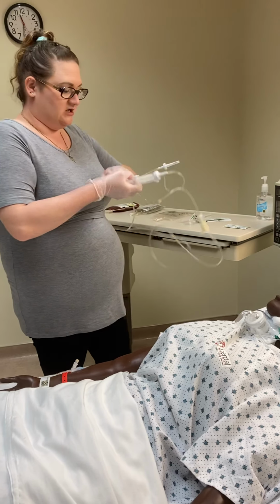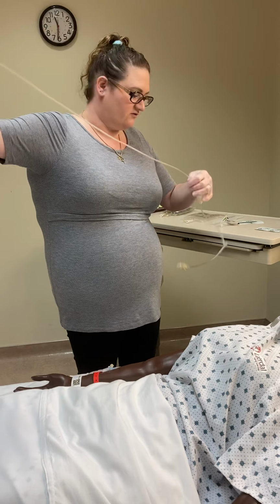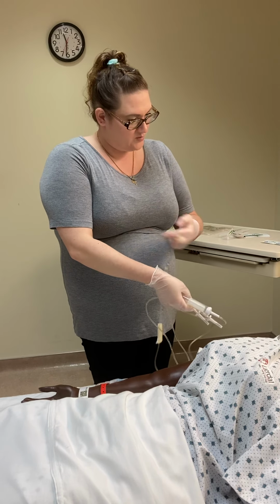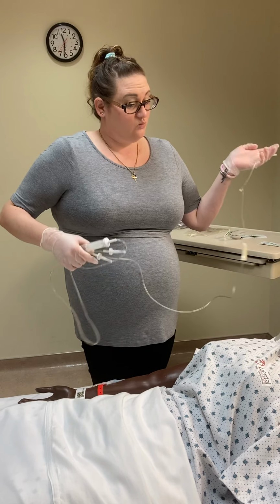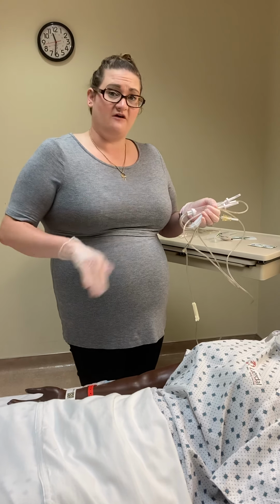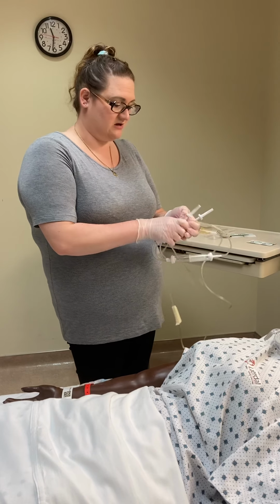All right, Mary Jean. So what I'm going to do is I'm going to get a little bit of some IV fluids running for you. This is just going to help keep your IV line open and running while I go and get your blood. I did her vital signs. She is stable. She's not febrile. She didn't have any pain. She says, okay, that's fine.